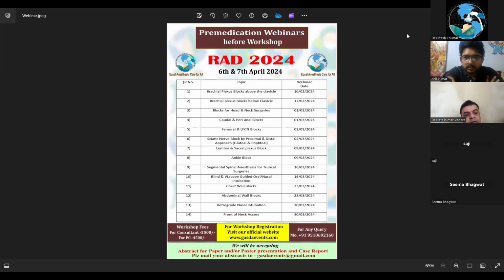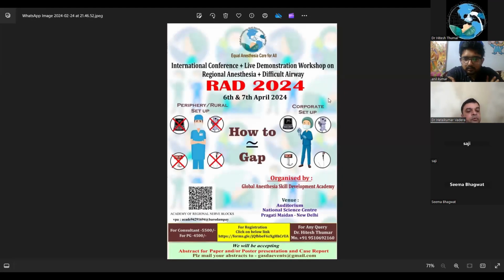Sir, in commando surgery, we give this block after induction of anesthesia only. Remember that when you induce the patient, you use propofol and scoline. So once the effect of scoline wears off, only then can you use the PNS. Otherwise, you won't get any response. So you have to be careful. You keep the plane of anesthesia deeper. After coming out of scoline, the patient will not have a problem. So keep the plane of anesthesia deep, and only after giving the block, give whatever long-acting muscle relaxant you are using.